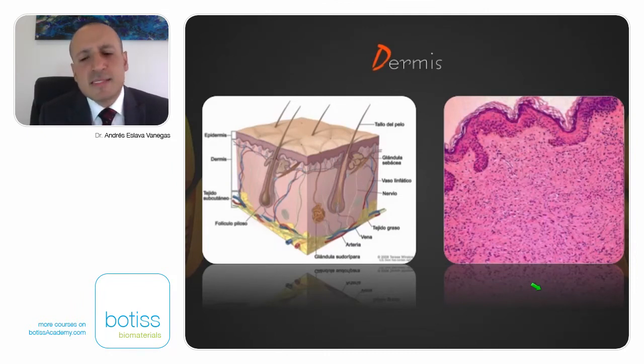Is that the only alternative that we have for periodontal plastic surgery? The answer is no. There is a material that has been on the market for about 30 years. There was only one company that had this acellular dermal matrix graft on the market, but from maybe 7 to 8 years ago, there are a lot of companies offering this kind of dermal graft. Now, what is important?